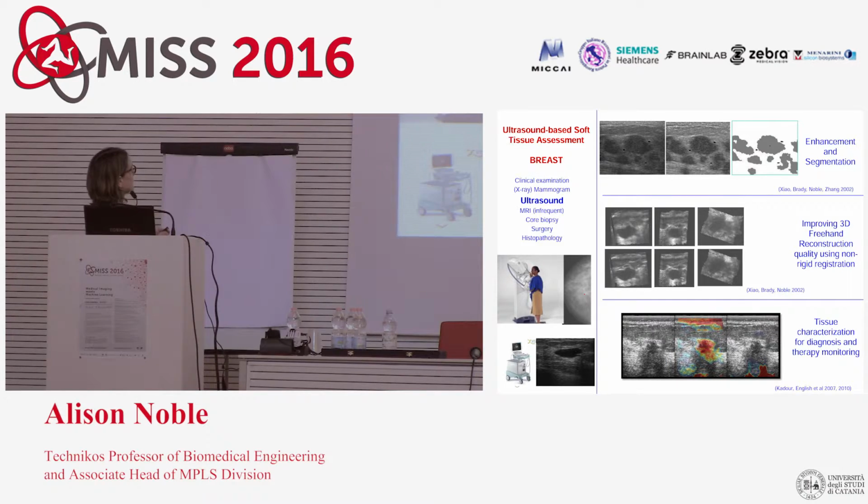Then if there is something suspicious in either case, you're referred to a clinic where you do an ultrasound. MRI is used for younger women, and if either the ultrasound or MRI still looks suspicious, you'll then go for a biopsy, and if cancer is found, go through surgery, etc. So ultrasound is really key in the middle, and its role here is to do characterization.